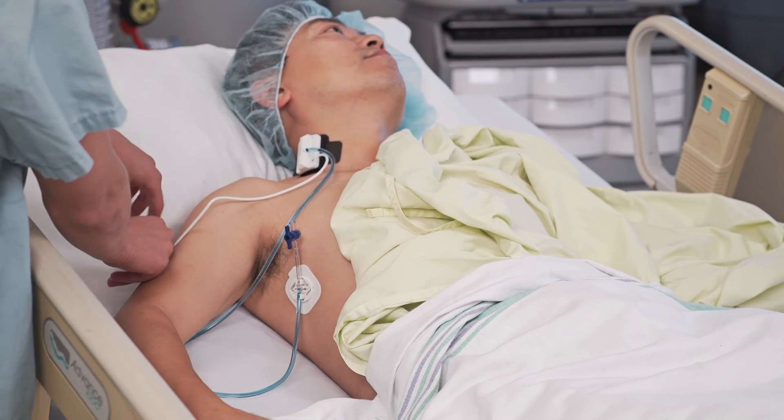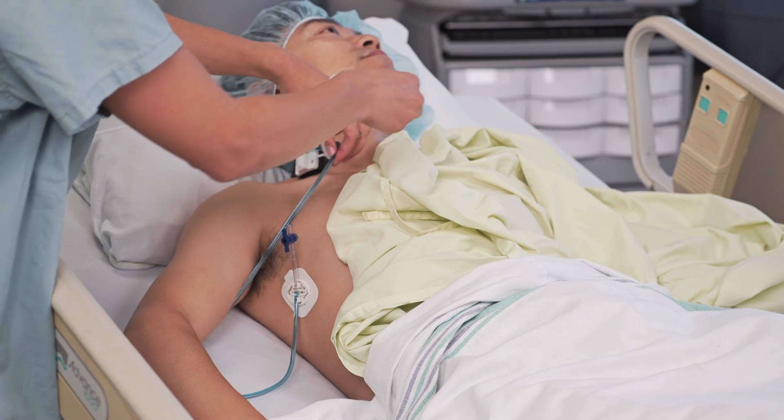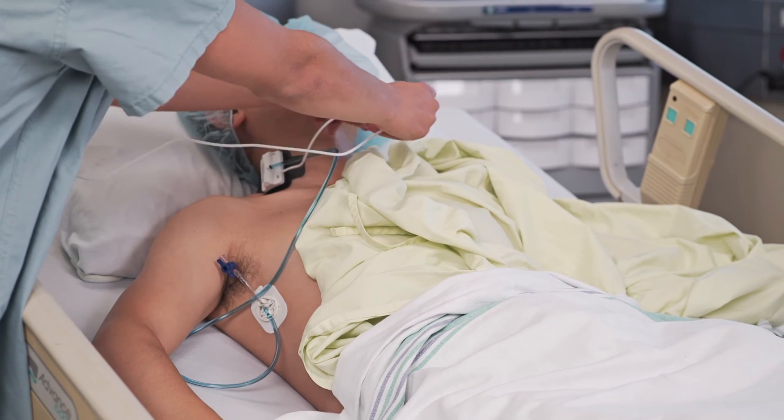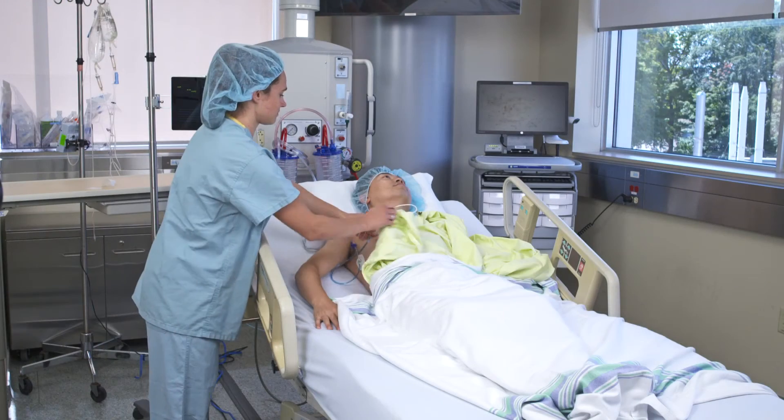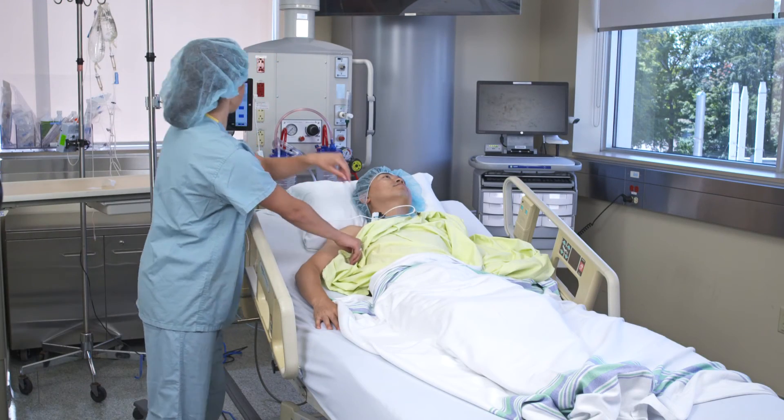Secure the cables by clipping them to the left side of the patient's gown. Instruct the patient to tilt their head slightly to the left and to remain quiet and relaxed during measurement.